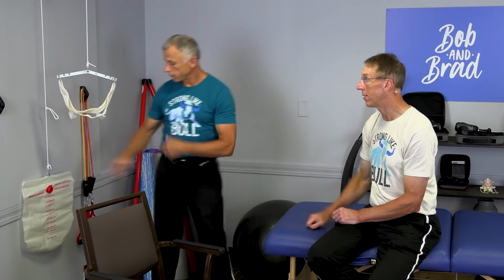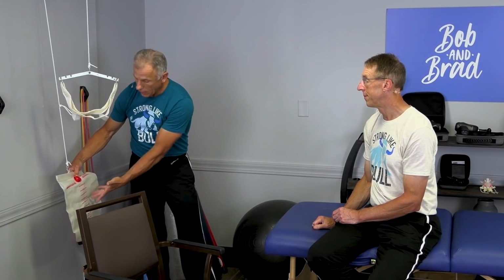So if this were to work for you, you'll often go up to 20 pounds. You'll get up there. Again, it should feel good. You don't put more pressure on just thinking it's going to pop and get better. It's not. You need to have complete control, good feeling, good response. The response has to be positive. All right, so that's a seated one.